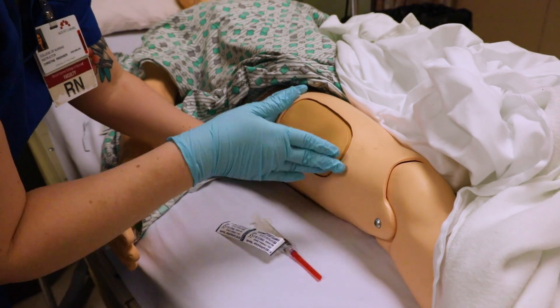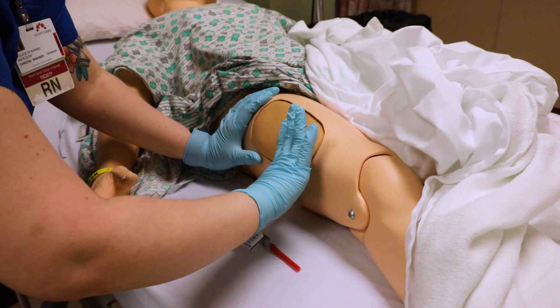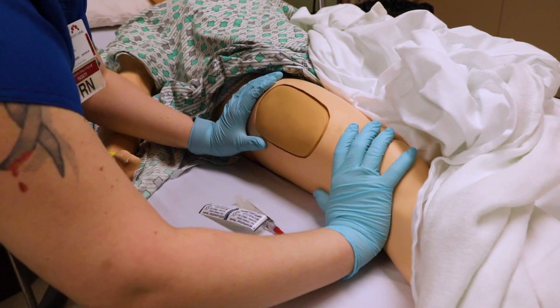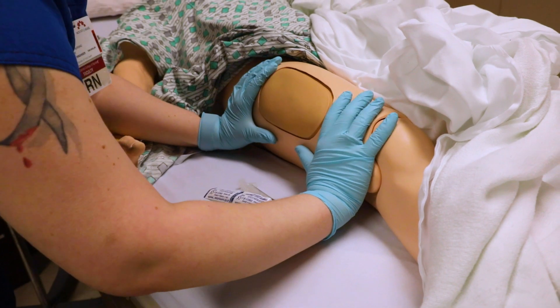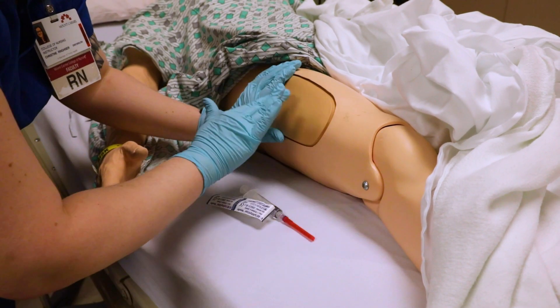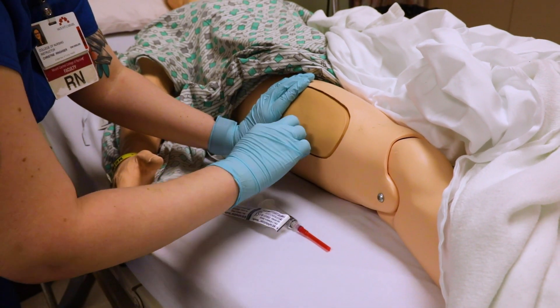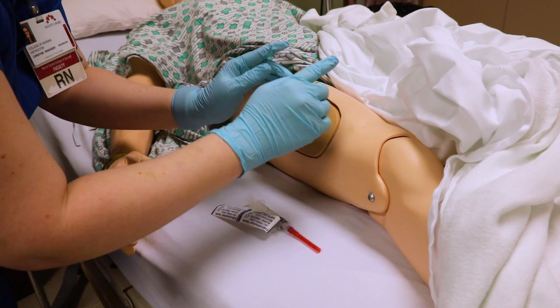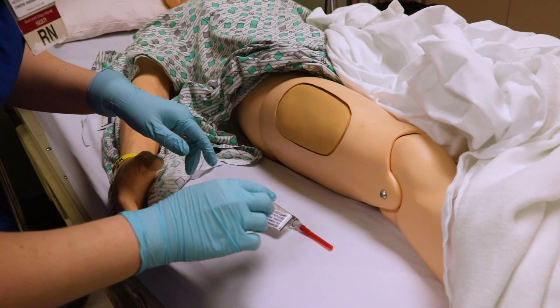Then you're going to find the lateral femoral condyle. Remember: lateralis is the side of the femur, femoral, and the condyle involves the knee. Put your hand here. That divides the thigh up into three parts: one, two, three. You're going to go into that middle part. So if you think of dividing the leg up, you're going to go into the top of the middle third.